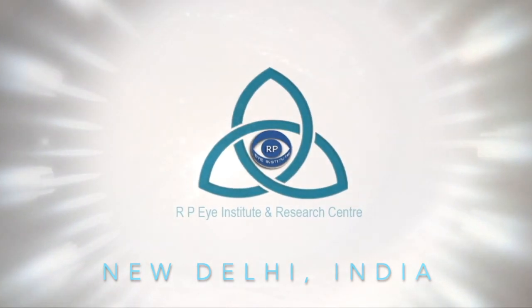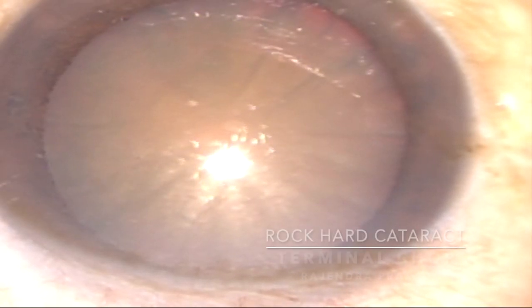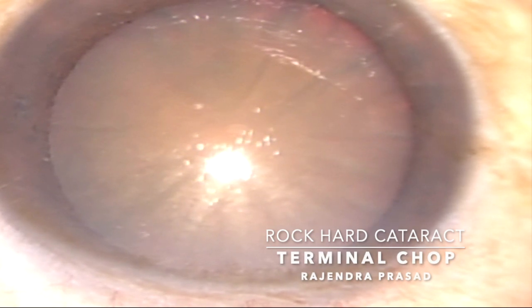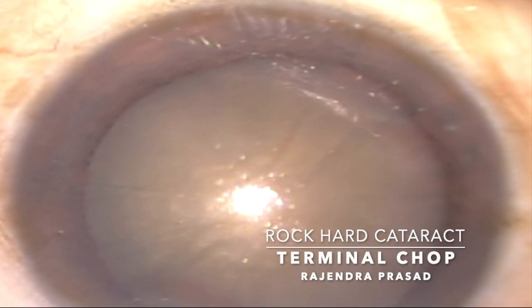Welcome to RP Eye Institute and Research Centre, New Delhi. This is the video of a mature hard cataract with total cortical nuclear opacification. We can see that the glow is very faint.